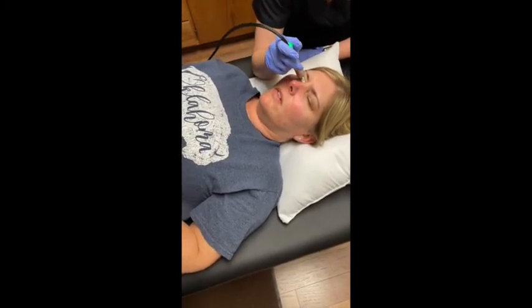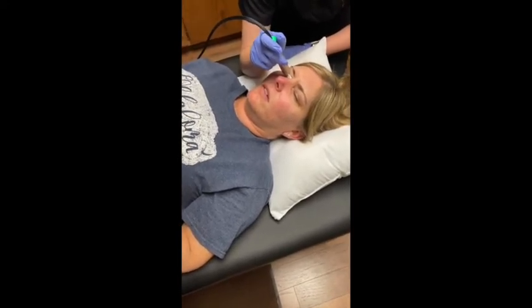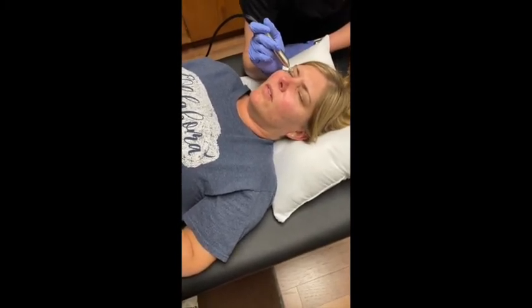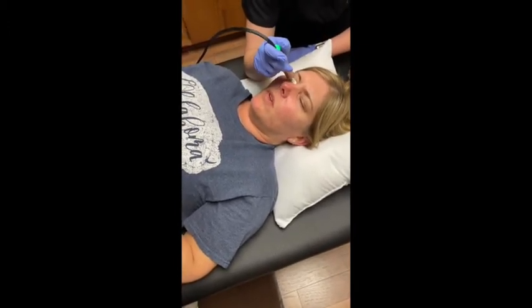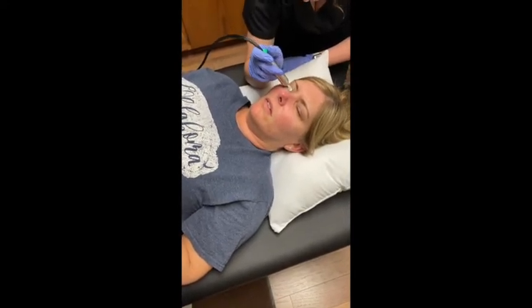The other thing that kind of messes with us, and I actually just did a video about it, is that we have an increase in styes going on right now. And so what happens is styes are basically plugged up oil glands, which this is clearing out, those plugged up oil glands.